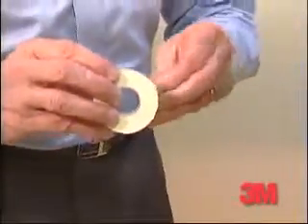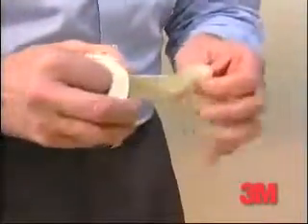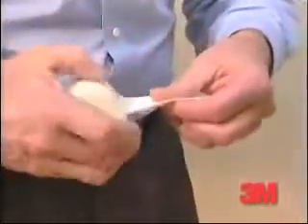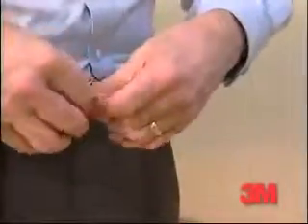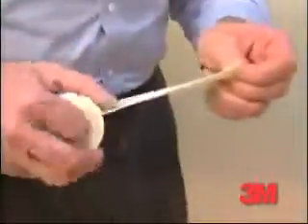For padding, we're going to use, in this case, what's called microfoam tape. It's a rubbery, stretchy material that will provide padding, and we're going to place a piece of this over the medial and lateral malleolar areas. Because it's a tape, it will stick to the padding and will not migrate underneath the material.